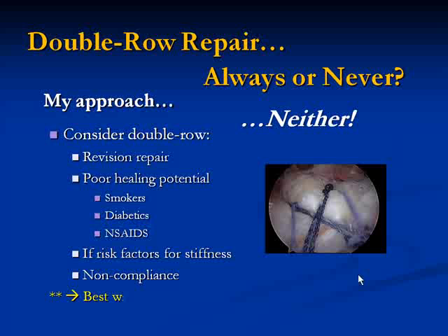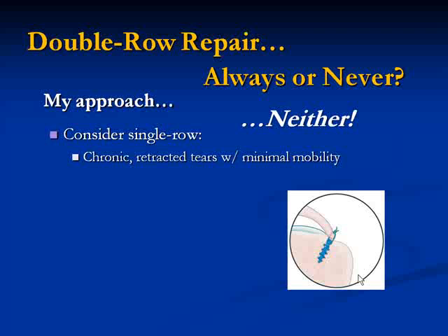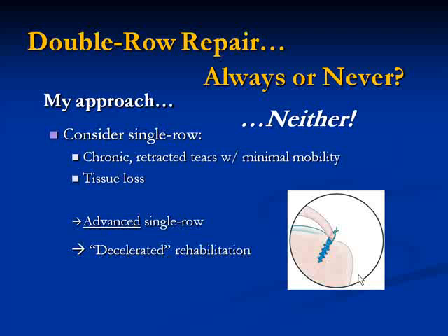But it's best to make sure that the tears are fairly mobile and we don't have a lot of tissue loss, because we don't want to make a mistake and over-tension the repair. And I will do a single row repair, particularly with chronic retracted tears with minimal mobility if there's been tissue loss. But I'll do a more advanced single row technique, such as Dr. Ree spoke about earlier, with a triple loaded suture anchor or an arthroscopic Mason Allen stitch for increased strength. And I will also consider a decelerated rehabilitation protocol to protect this more fragile fixation in the healing period.